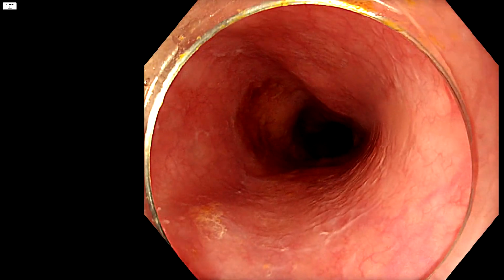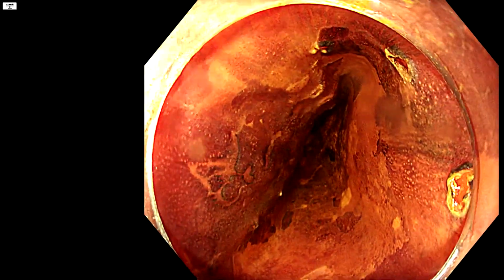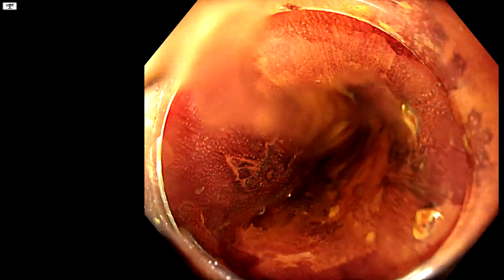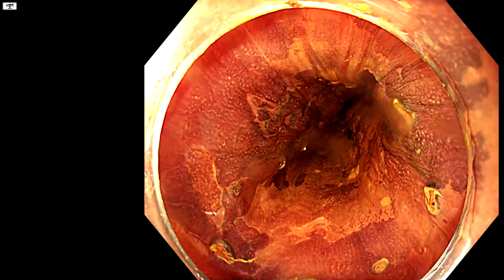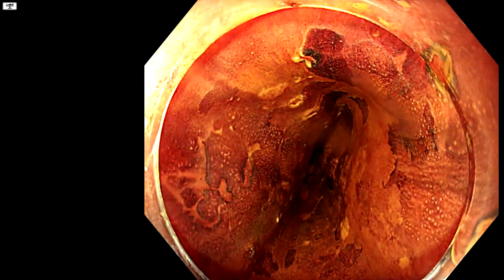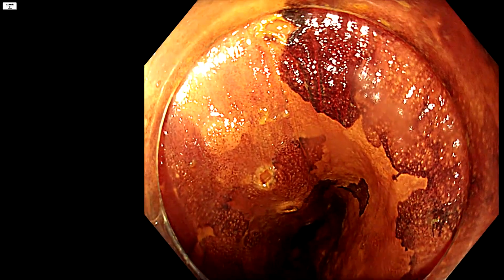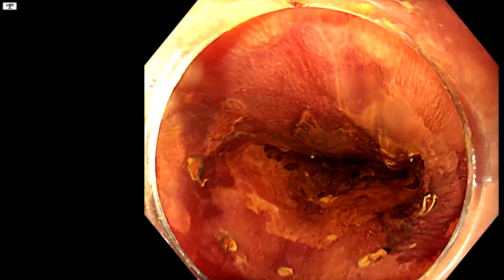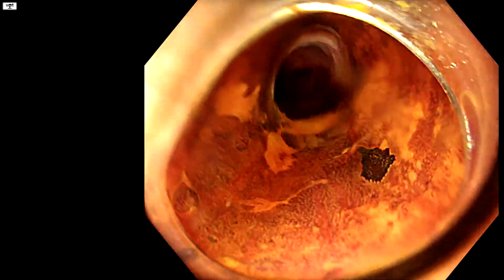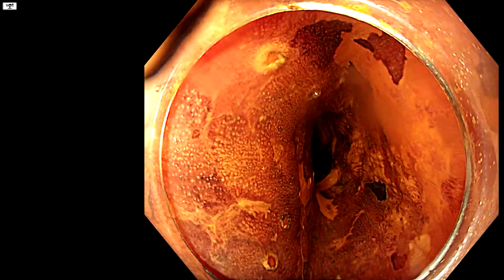Because we come up here, we don't have any Lugol anymore. So I think this confirms to me that my dots are okay. So we go ahead and just check the edges of my dots. This maybe is something worth checking more, but I'm still not terribly convinced about that area at the top. I think it's probably ending right here, right in the dead ahead position. Difficult to tell. Consider that in a second. And this edge looks to be all right. Apart from here, where we would want to go a little wider.